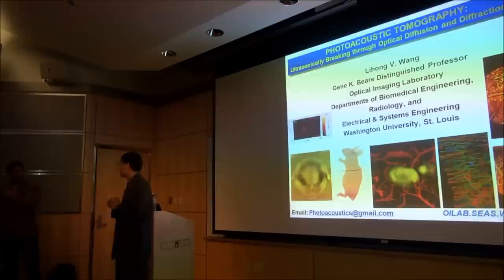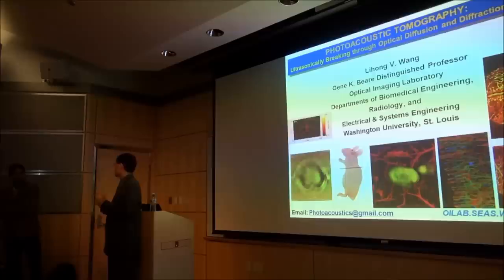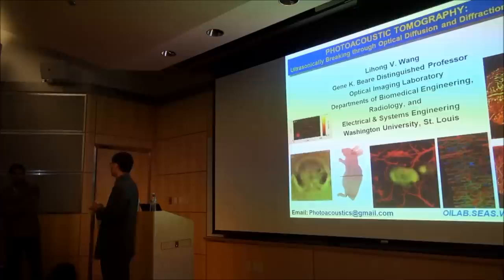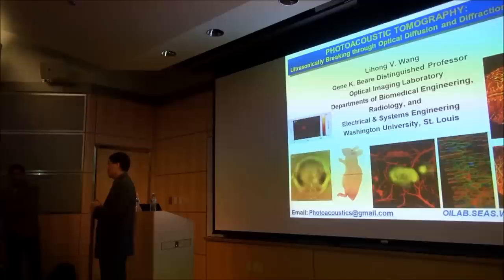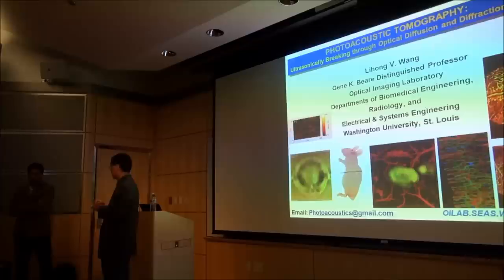Do you have the laser technology to do that? Well, we have, for example, one laser that allows you to tune the wavelength from 200 nanometers all the way to 2 microns. The technology's out there. The tuning is reasonably high speed, depending on what you mean by high speed. You do have to use a dispersion element that you mechanically rotate, and that can be automated. And there are ways to speed up the transition by using some other elements. Sometimes you can have multiple wavelengths fired at the same time, and you just pick the one you want to work on, if it's a discrete wavelength.